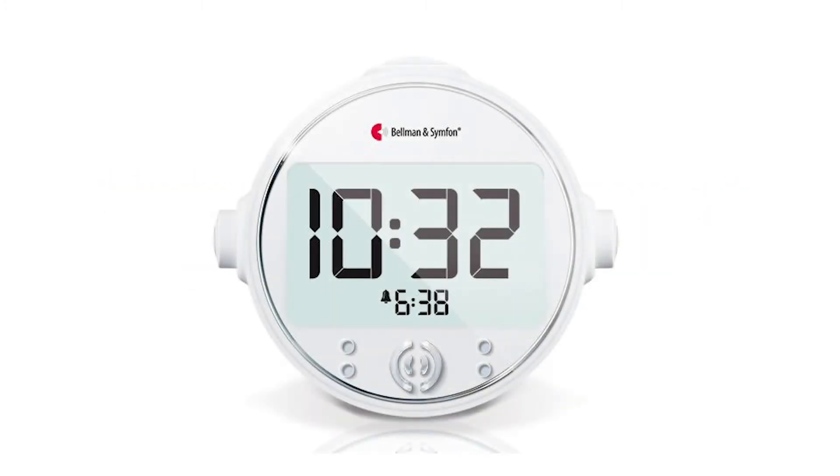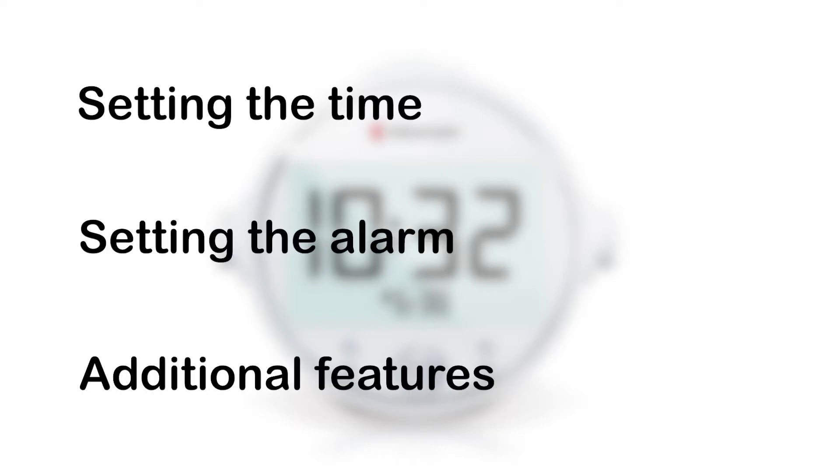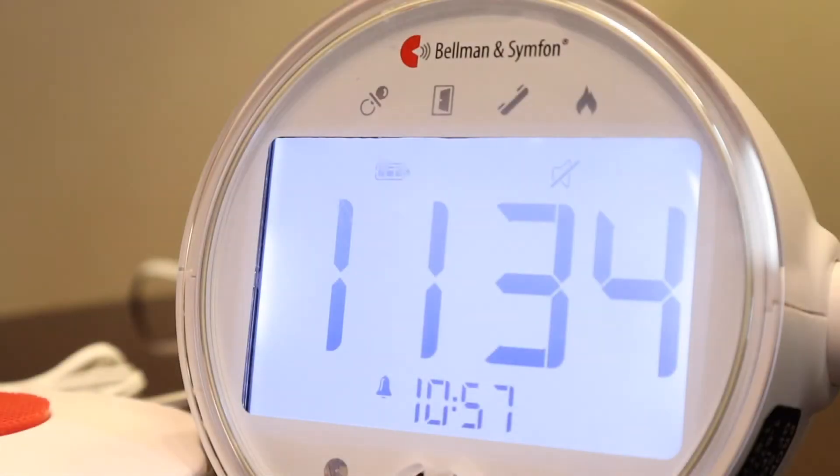In this video, we will demonstrate the main features of your alarm clock. First, let's set the time.